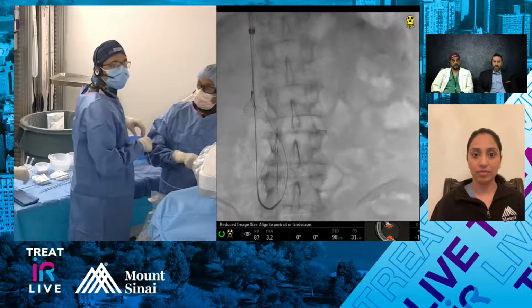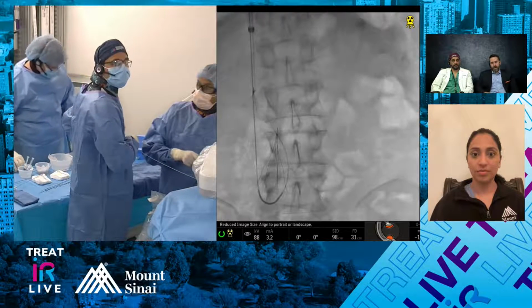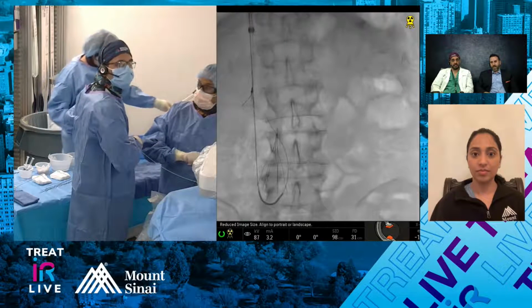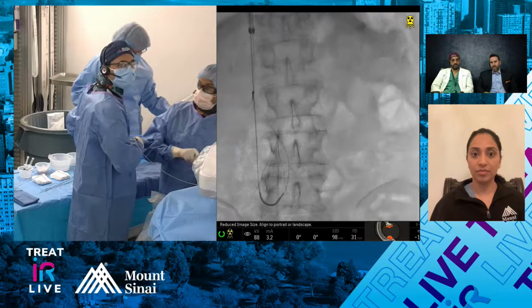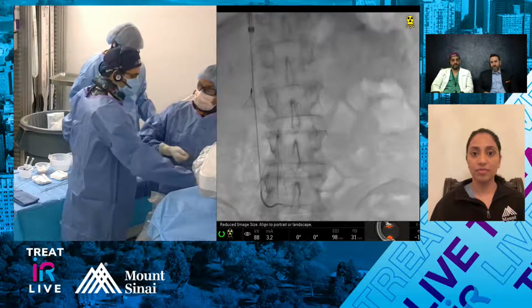The pre-op imaging is really critical for that. In terms of embolic protection, are you going to be doing just the newer sheaths that come with embolic protection, discs, half open stents? What's your go-to?